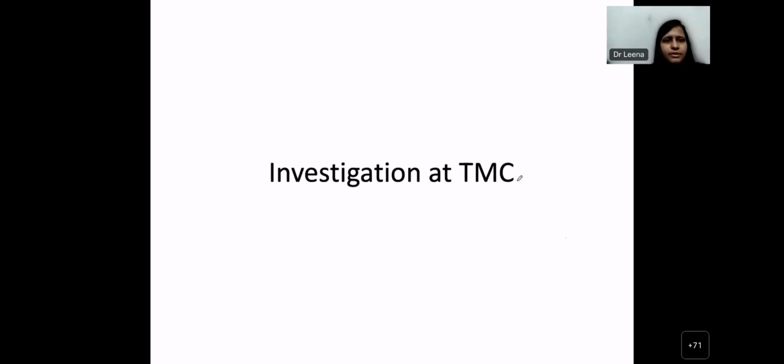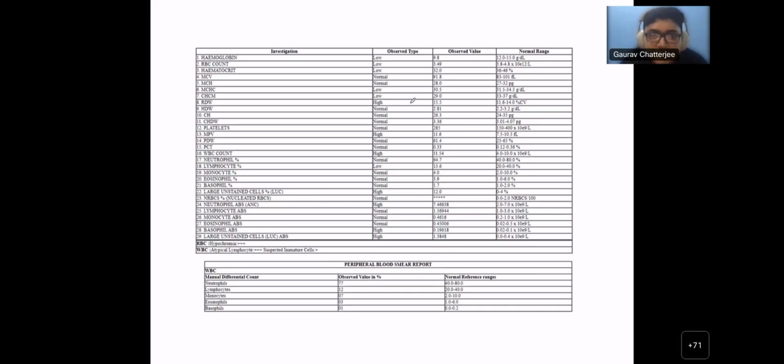Let's not consider the X-ray and all right now. So again, lymph node, fever, hepatosplenomegaly. What first? So we can examine the complete blood count. Absolutely. I have not given you the count yet. So that's the first thing you have to check, right? I have just given this case exactly like it came to us. So you can just talk about hemoglobin, platelet, and WBC count. You can see them, right? What do you think?